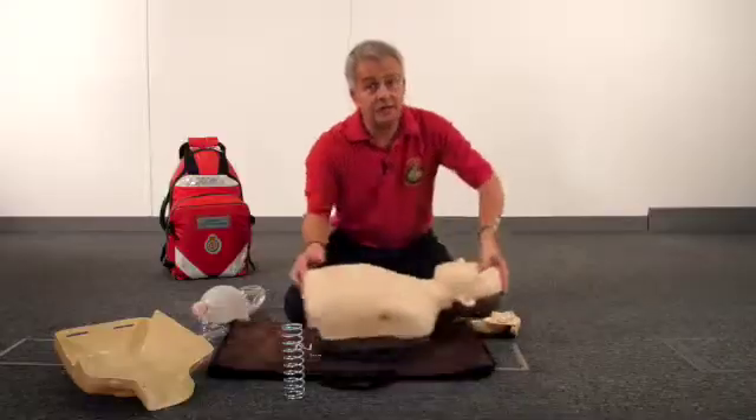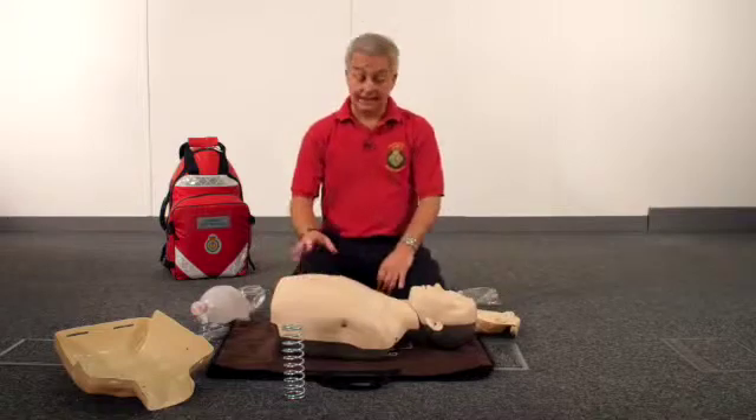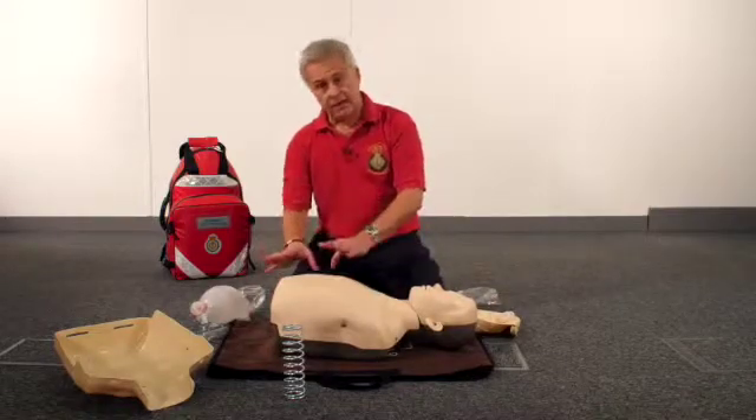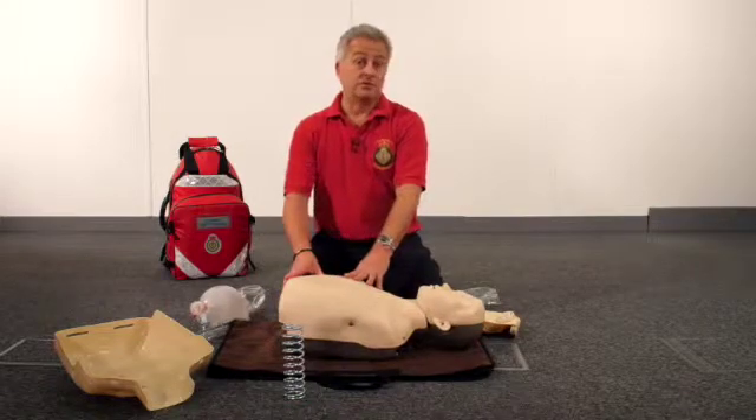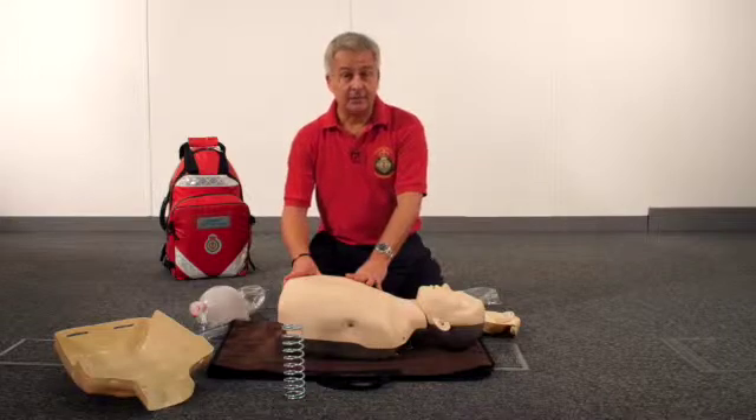So this is the Brayden Junior Conversion Kit — it allows you to convert the adult Brayden into a junior mannequin whilst your students are having a cup of tea and a short break. Thank you very much.